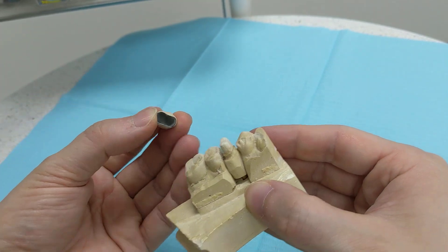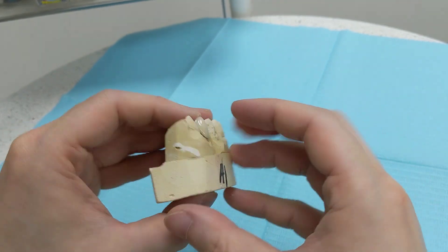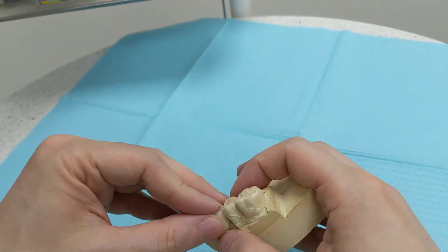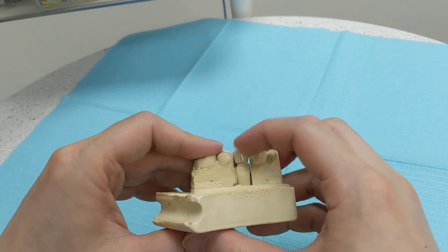There is a limit to how much you can shave down, because you don't want to shave through the crown and expose the tooth underneath. If you need major adjustments, you should probably have the crown redone. But otherwise, it's a very quick process.